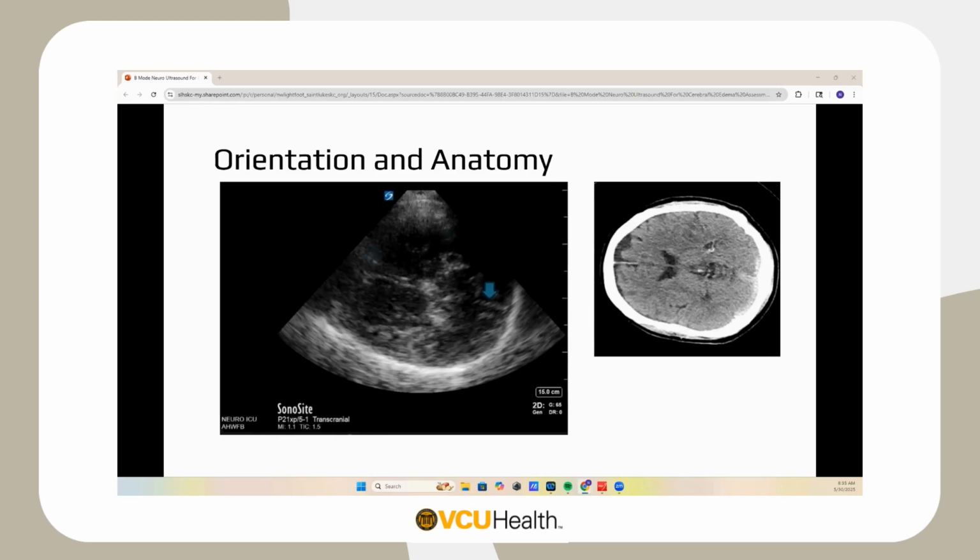This image is the same one, but what we're really pointing to here is that using the ultrasound, you can pick up on meningeal projections in the brain. This one in particular is pointing to the posterior portion of the falx running between the two hemispheres.